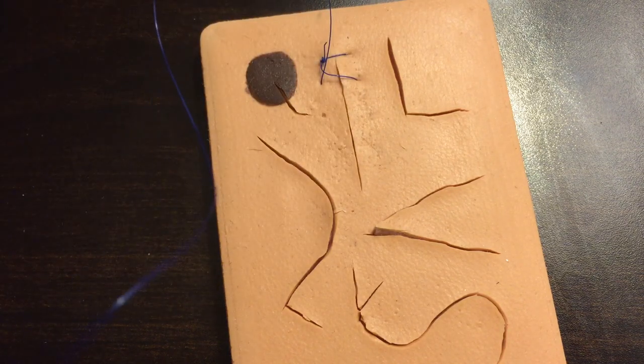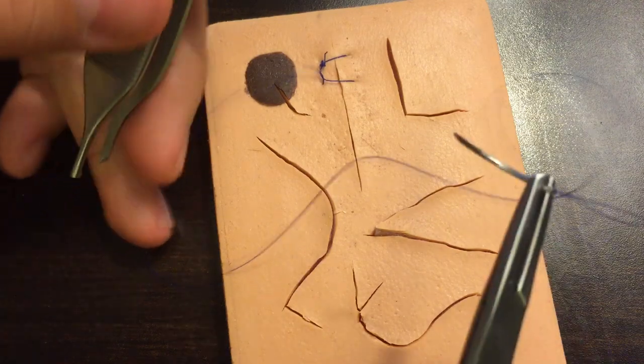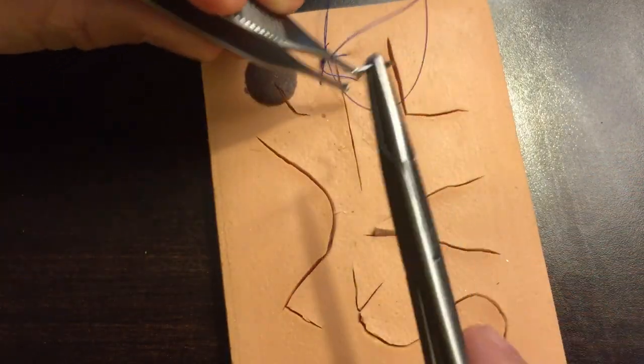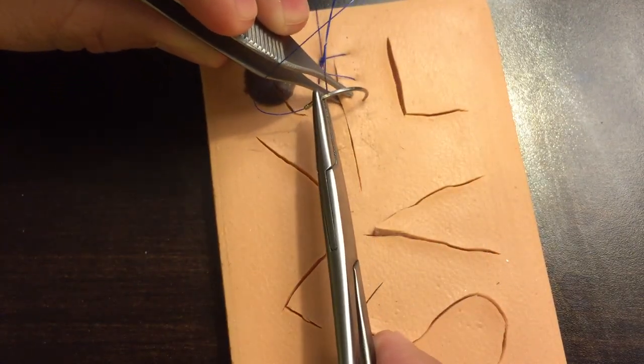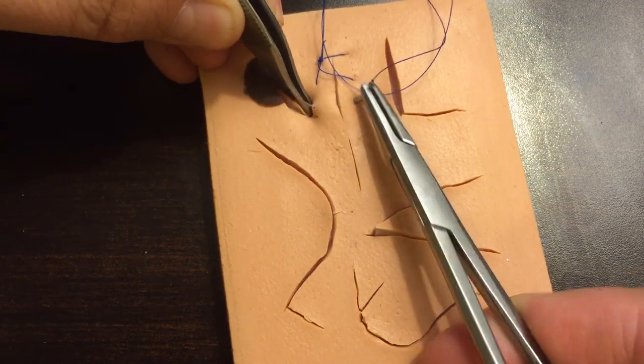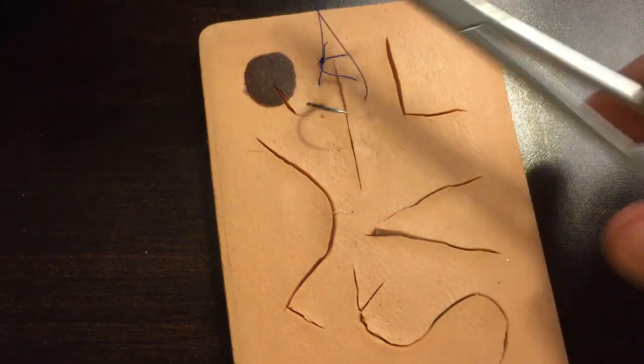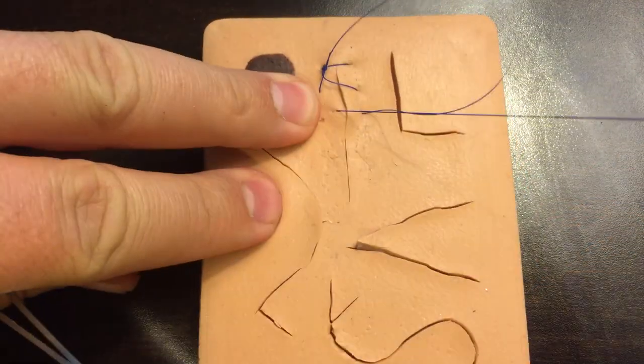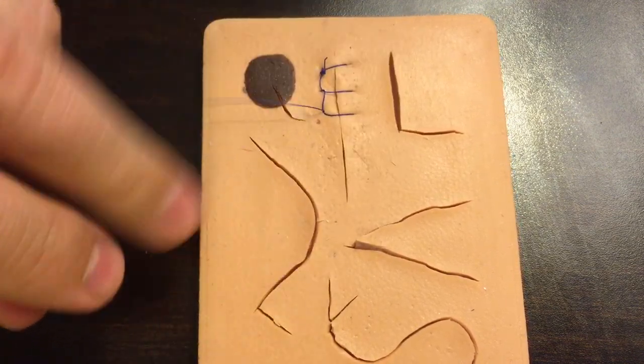And you'll see as we continually do that down this laceration, it's going to keep it all locked together nicely. Now it might loosen up while you go to the next throw, and that's just fine because these are really simple to tighten as you go. So we're going to go with another throw here. And again, as we pull this through, we want to make sure that we're pulling it through that loop rather than outside of that loop. That's going to lock it down. See how that's working.